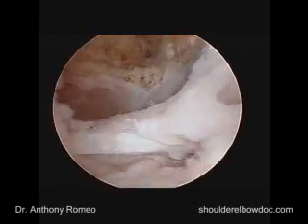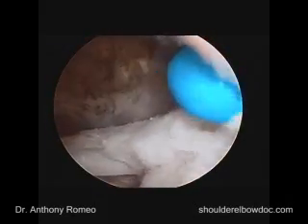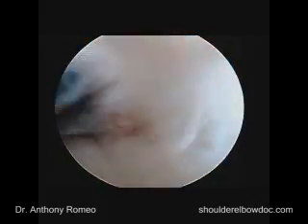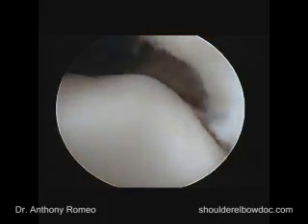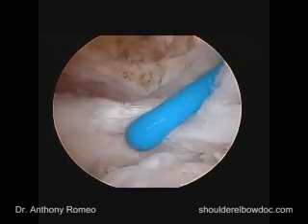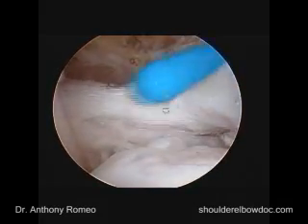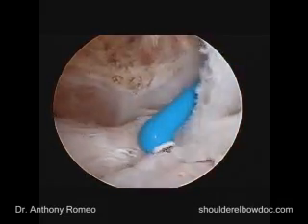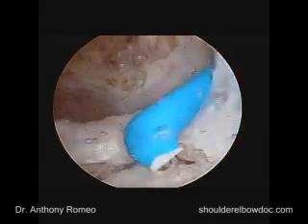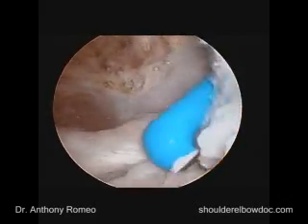Now we've cleared out that front space, and we recognize we have to deal with this. This is where the biceps sheath is right here. We have the tear of the supraspinatus a little bit further back. We're going to have to deal first with this subscapularis injury, which is more of a split of the tissue. There have been some changes at the attachment point, so we'll clean this up to prepare for reattachment of the subscapularis and determine our strategy for what we're going to need to do.